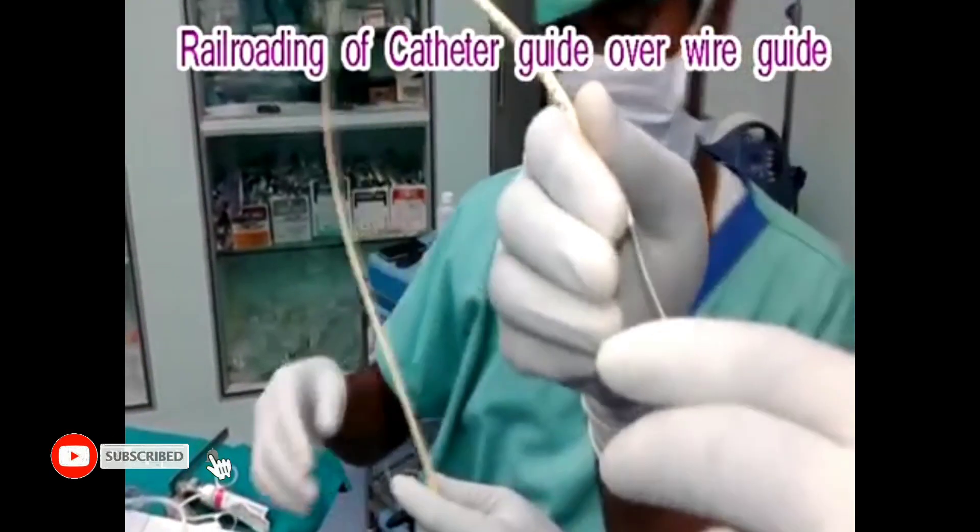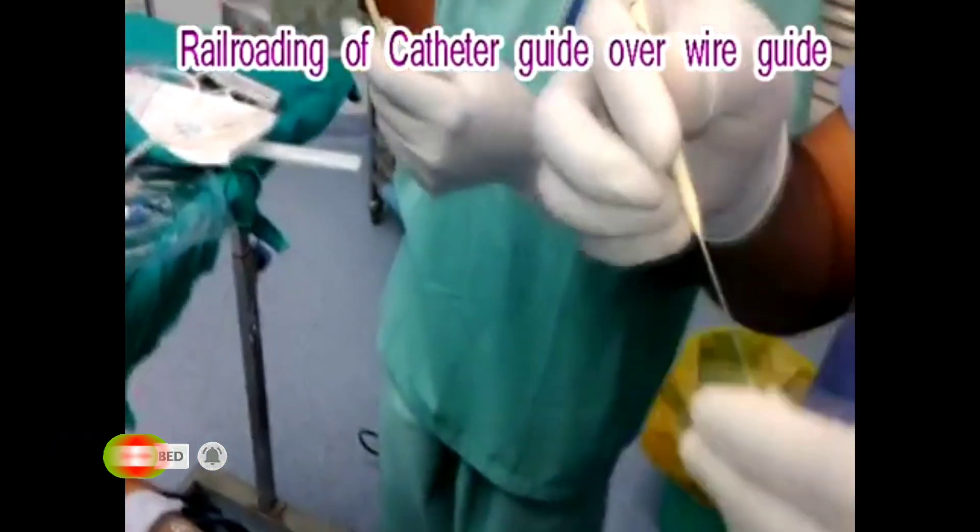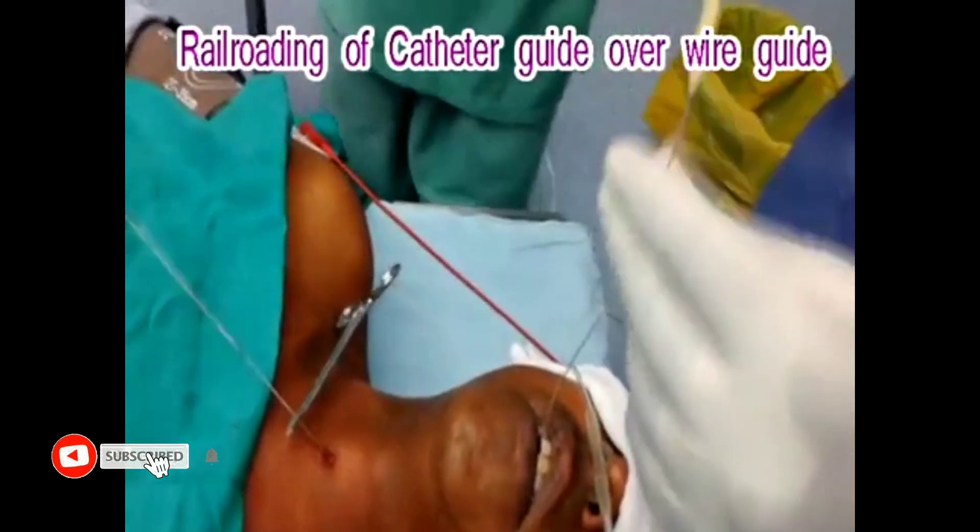Then the catheter guide, lubricated with water-soluble jelly, is threaded over the retrograde wire until it reaches the puncture site behind the cricothyroid membrane.